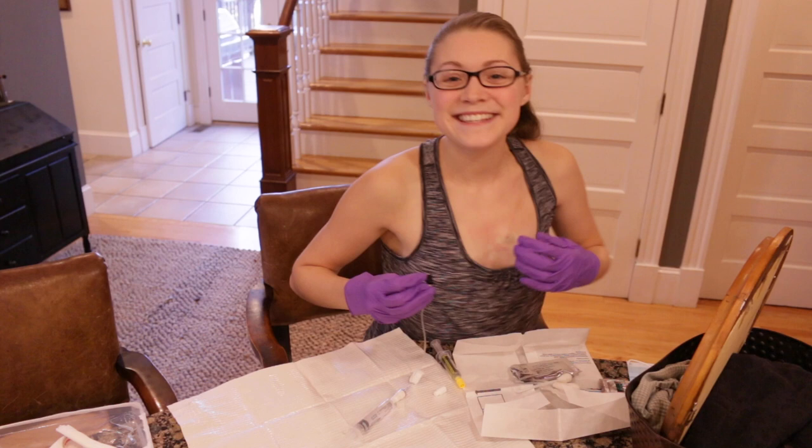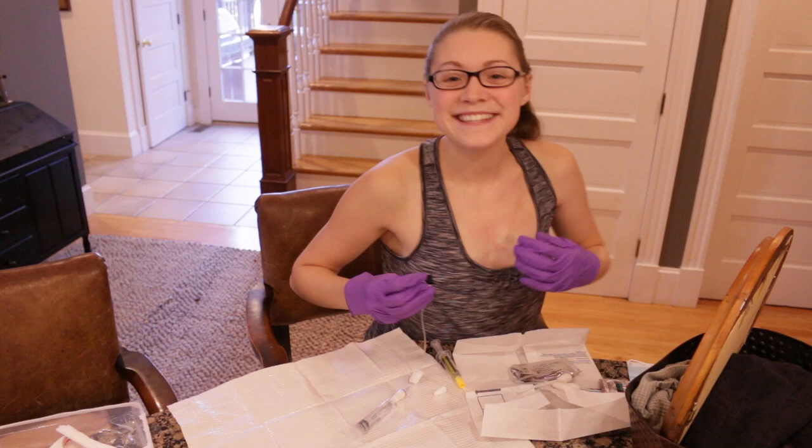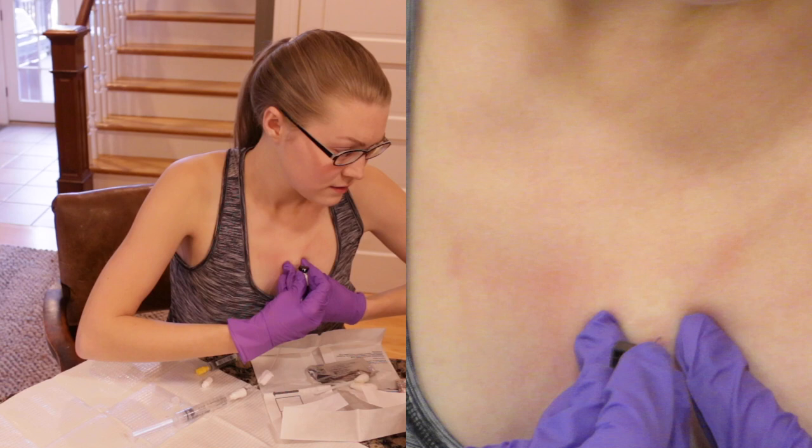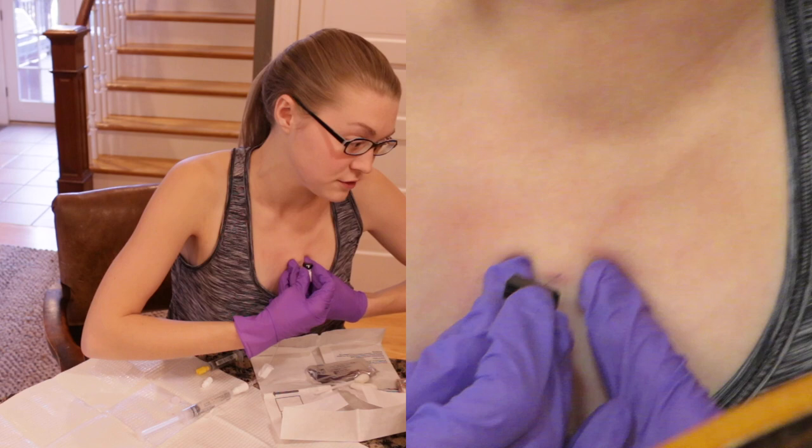I cannot see — I remember doing this back in college, I used to say I can't see. You want to go straight in, straight into the back of the port. You do have to apply a pretty good amount of pressure to get the needle to go through the port and into the back.